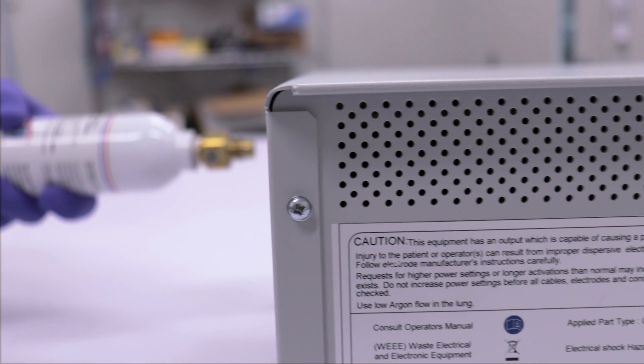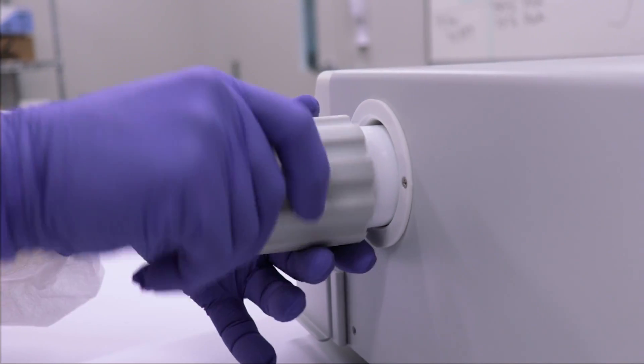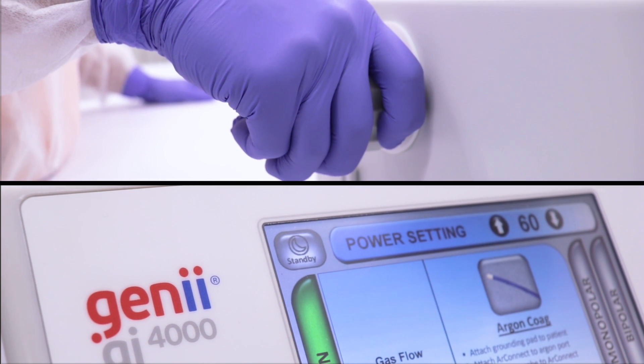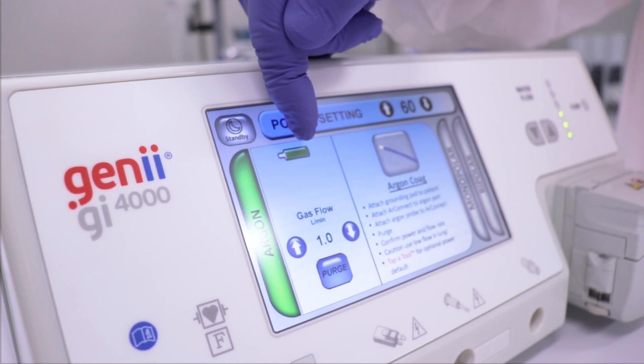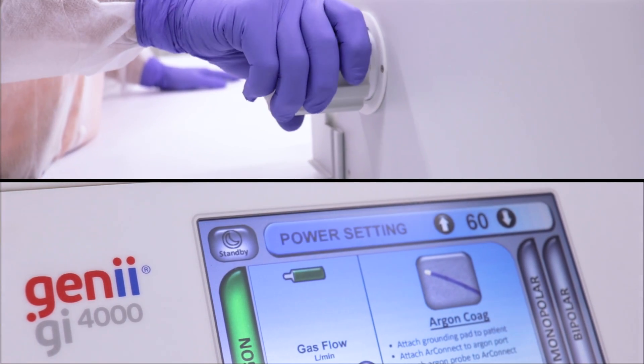Carefully align and insert the argon gas bottle, valve end first, into the port located on the right-hand side of the GI-4000. Screw in the argon gas bottle clockwise until it is fully seated, and you observe a green gas bottle icon appear above the gas information section. Continue turning clockwise until the argon gas bottle is fully engaged.